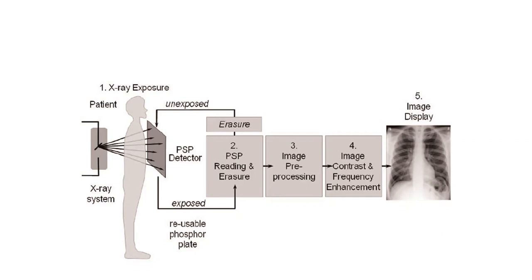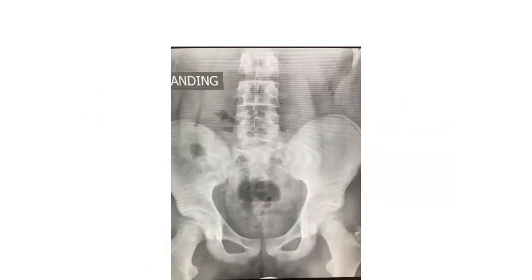All right. If you ever thought about how a picture gets made, it's about saturation and contrast, the weighting of the pixel, and the contrast to the adjacent ones. And we can actually manipulate those variables on the post-processing too. But basically, we want to try to create a digital radiograph that looks just like the film, the other chemical radiograph, and they last forever if you have a place to save them.